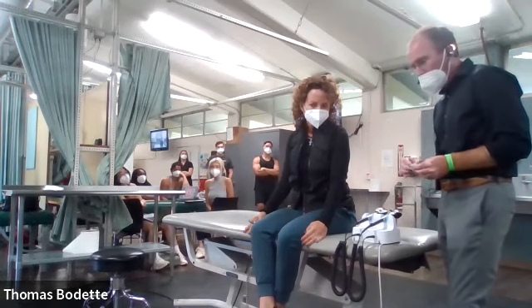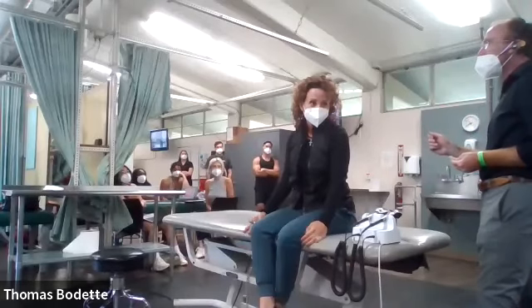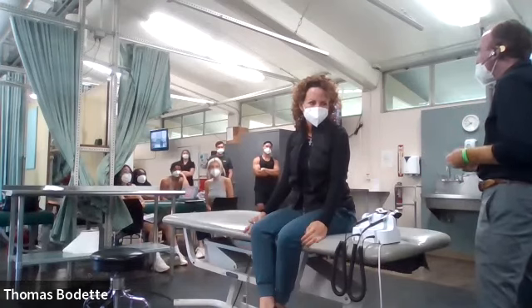So it's real easy to insert too far. So whatever precautions you can make to not only see everything, but also make sure the patient's nice and safe, we're going to be watching for.